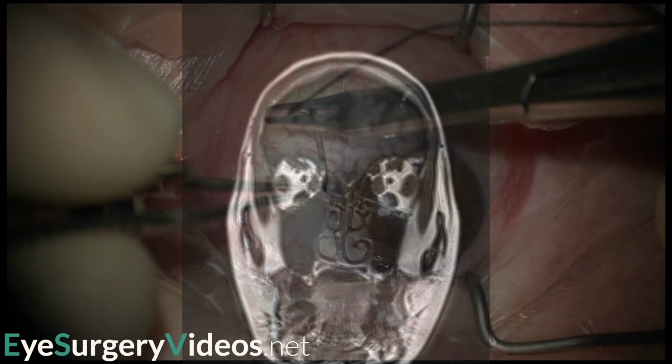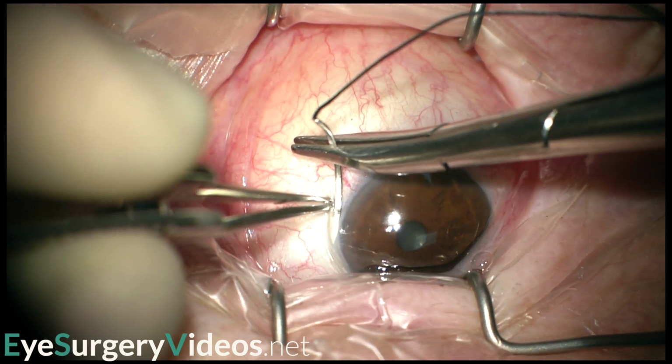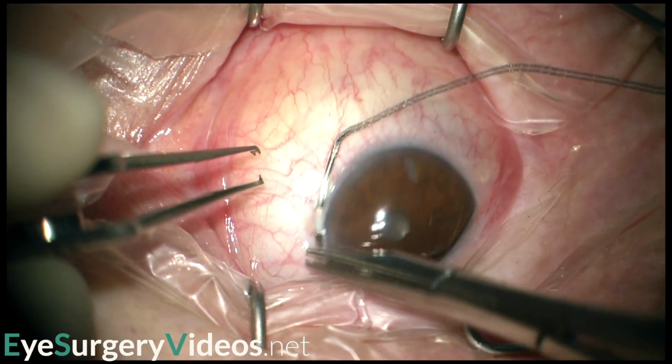The eye is prepared using aseptic technique, with the lashes retracted as per squint surgery to avoid inadvertent foreign body retention within the subconjunctival or subtenon space. Post-operative granulomas secondary to lash retention have previously been described.